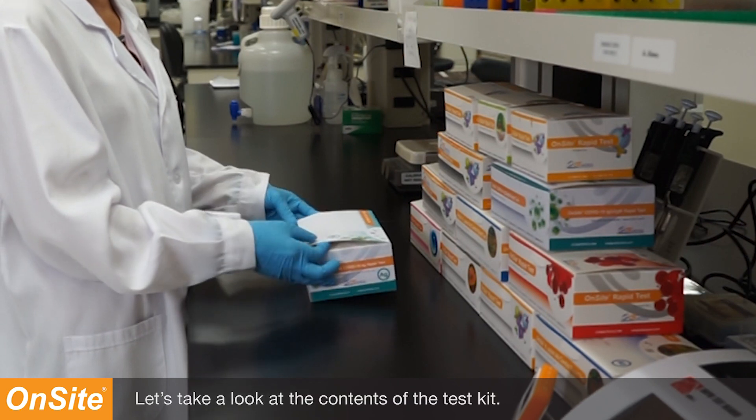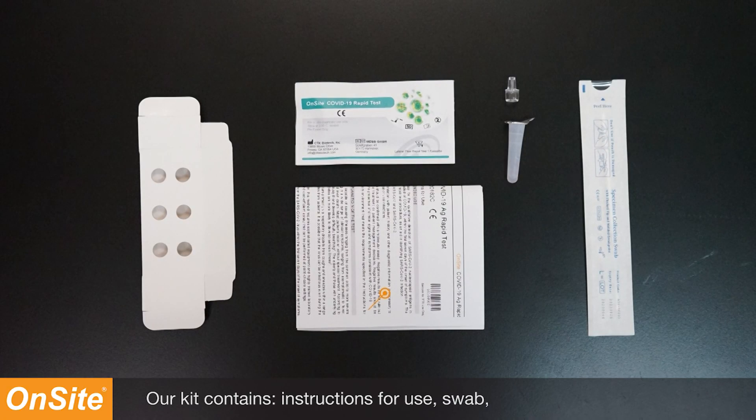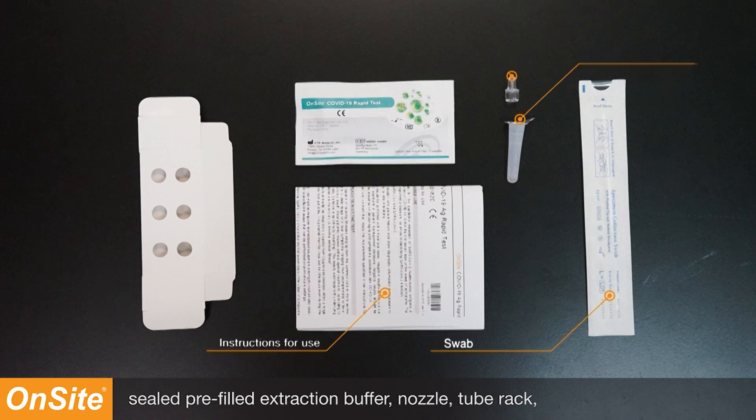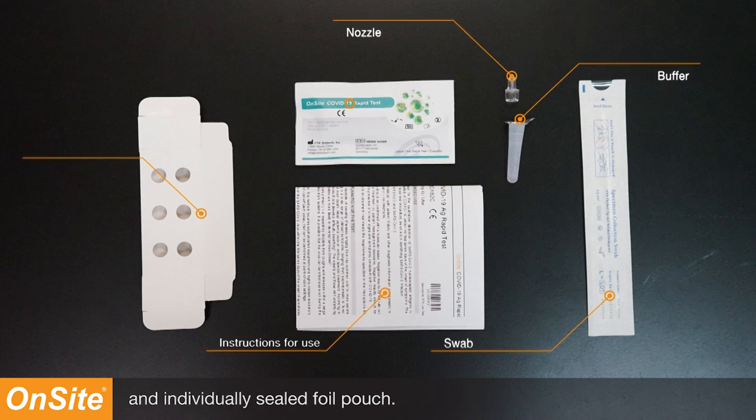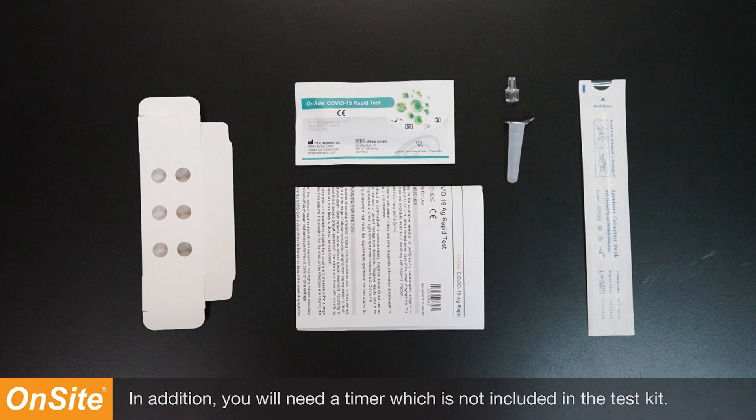Let's take a look at the contents of the test kit. Our kit contains instructions for use, swab, sealed pre-filled extraction buffer, nozzles, a tube rack, and individually sealed foil pouches. In addition, you will need a timer, which is not included in the test kit.